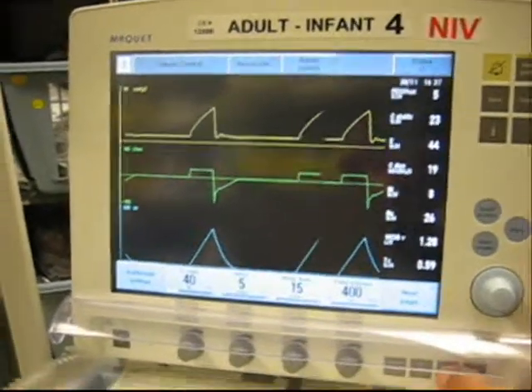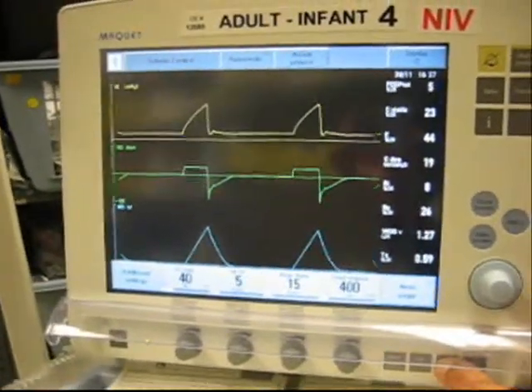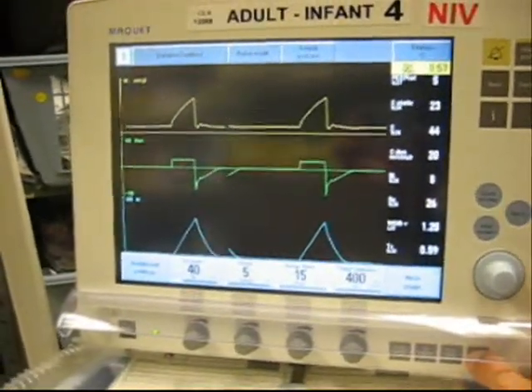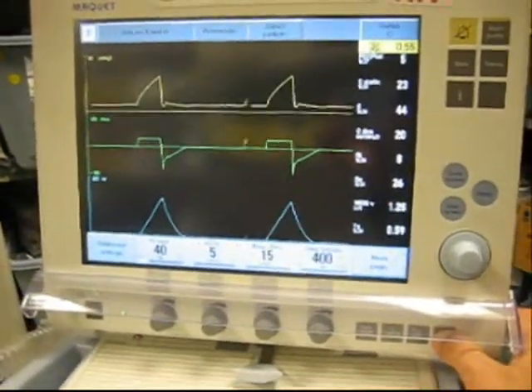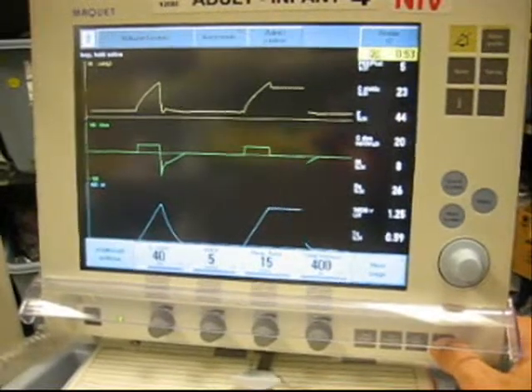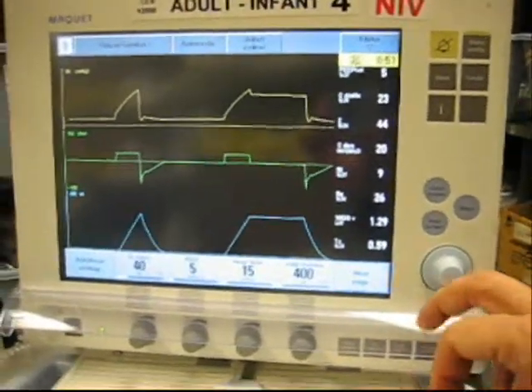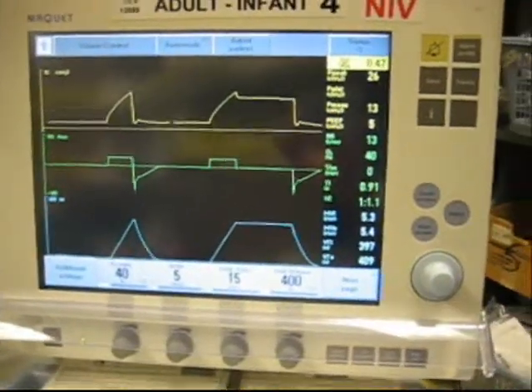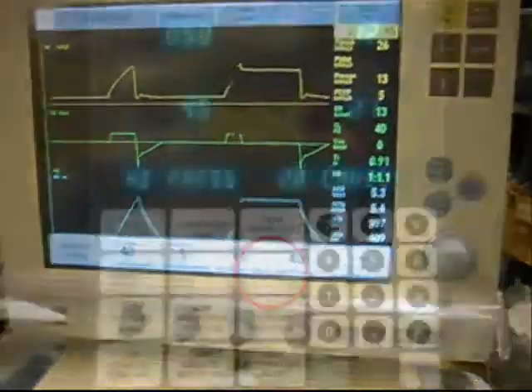Implement the procedure and ensure patient safety and comfort by monitoring using the bedside monitors. Where possible, do an expiratory pause maneuver, followed by an inspiratory pause maneuver to ensure that gas trapping inadvertently does not occur during the procedure.